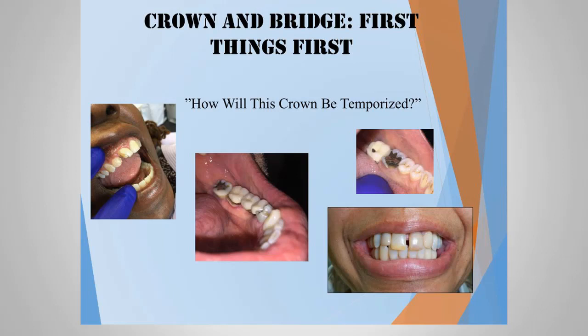As you can see here in this left-hand side, where the patient has a broken crown 7 and 8, in this situation, I probably would do the same thing in terms of just placing composite on these teeth without the bonding agent, just giving them the form and shape that they would naturally have, and then taking an impression over that to make the temporary matrix. In this situation, we have tooth number 18 with open lingual margins. We're replacing this crown. So in order for me to get a good shape so that I can take an impression for the matrix on this tooth, I would just simply use some flowable composite, close up the open margins, and then take an impression of that.